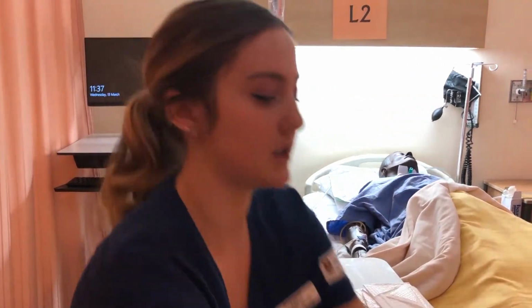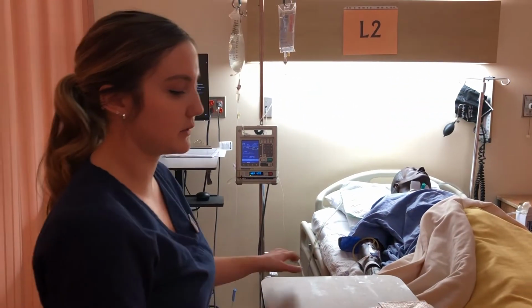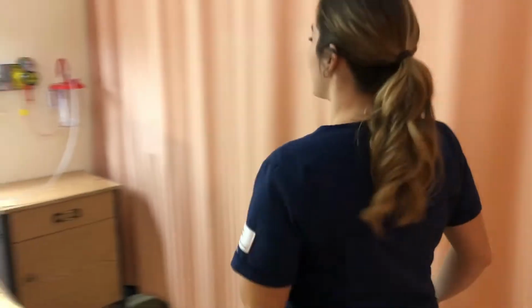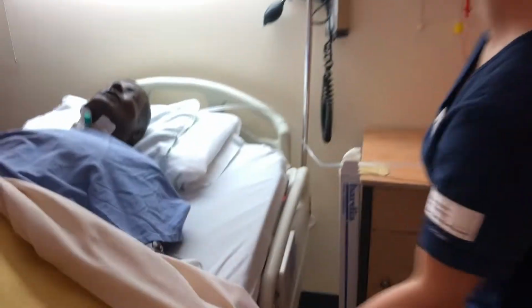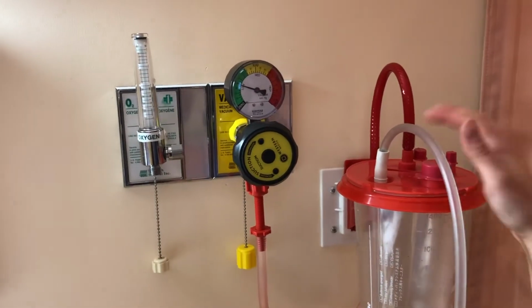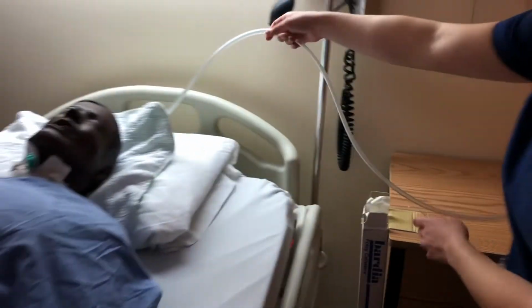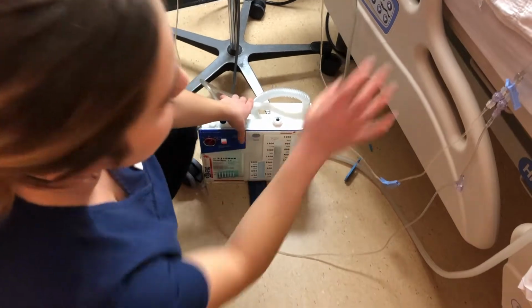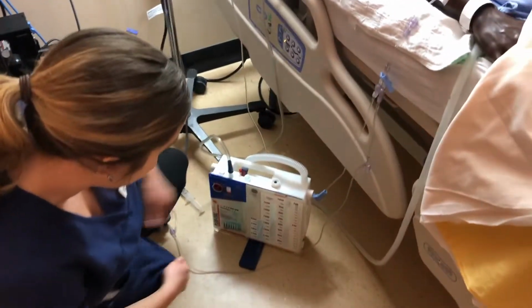With chest tube patients, there are certain safety checks you have to do when you enter their room. So I'm going to show you. My patient's order for suction was to be on low, and it is on low already, so I know that her suction is good. I'm going to follow her suction tubing all the way down to the drainage device over here, making sure that there's no dependent loops or anything, there's no clots, and it's below my patient's chest cavity and it's flat on the ground.